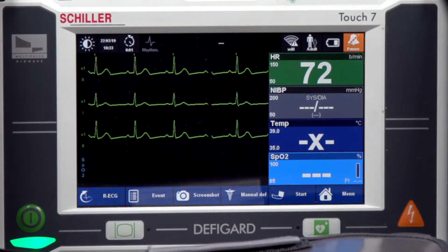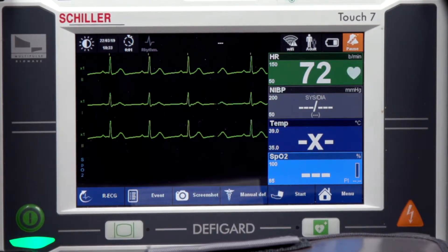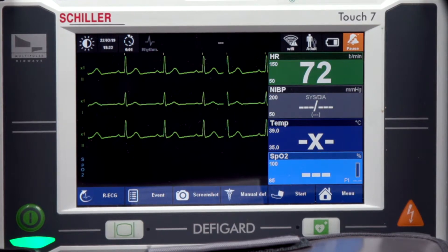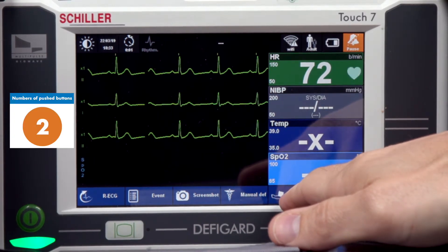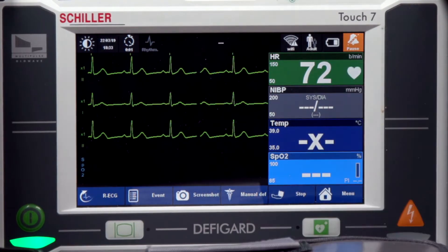I'm going to take out the non-invasive blood pressure cuff and apply it. Then press the NIBP start button, which is the arm icon with a cuff wrapped around it and the word 'start' next to it on the screen.